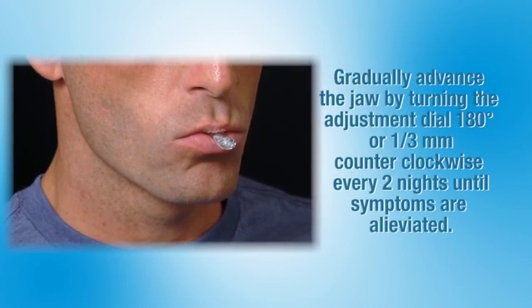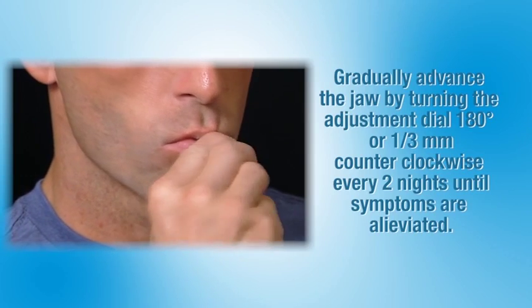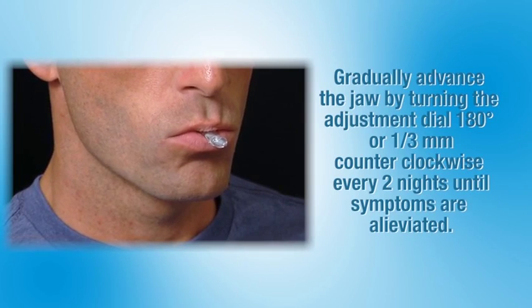Gradually advance the jaw by turning the adjustment dial 180 degrees or a third millimeter counterclockwise every 2 nights until symptoms are alleviated, unless other advancement instructions have been given to you by your prescriber. It may take several days to reach your ideal treatment position.